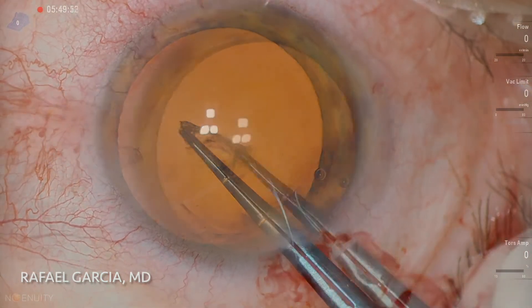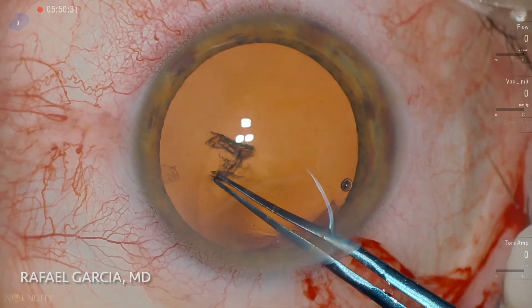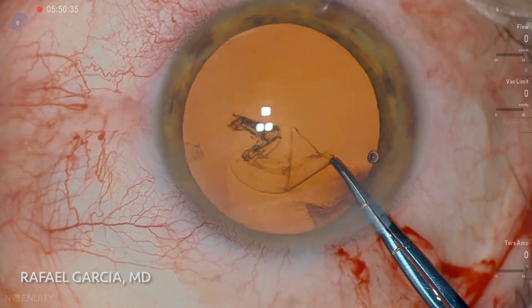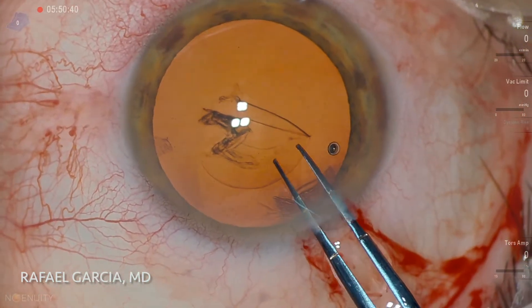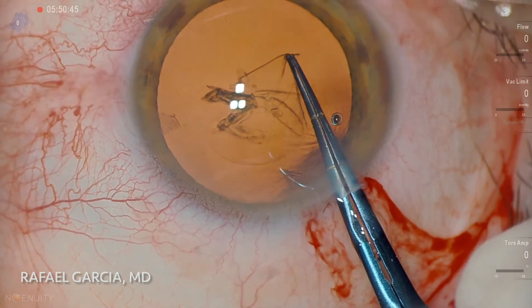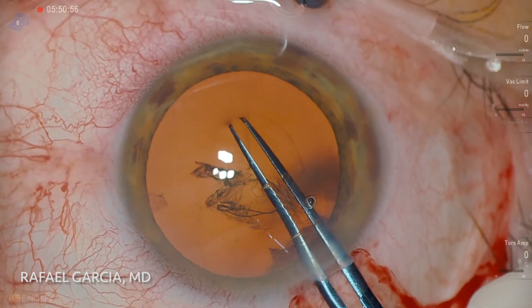The surgery is done under topical anesthesia. As the red reflex is quite good in this digitally enhanced image, there's no need to use trypan blue dye to stain the anterior capsule. Therefore, we can just skip this step and go straight to the capsular rhexis. One advantage of this cutting-edge viewing system is that it provides a great depth of field and depth of focus for the surgeon.